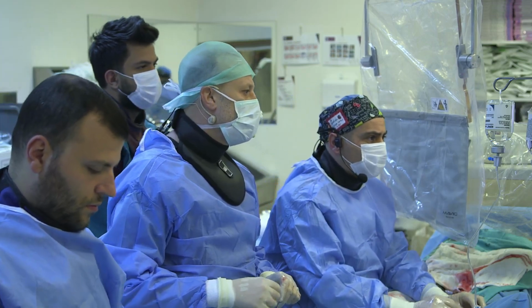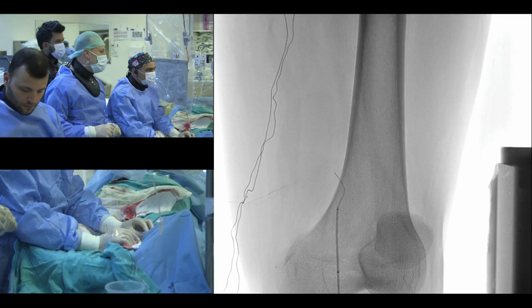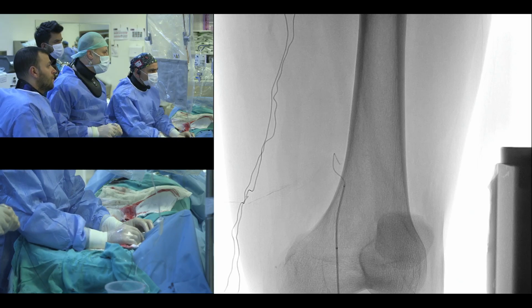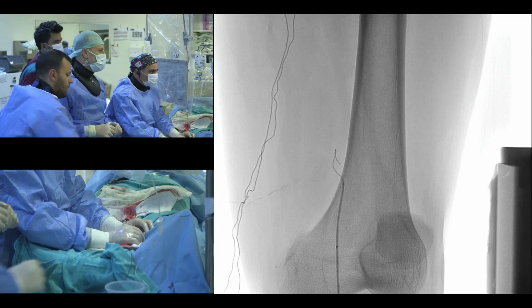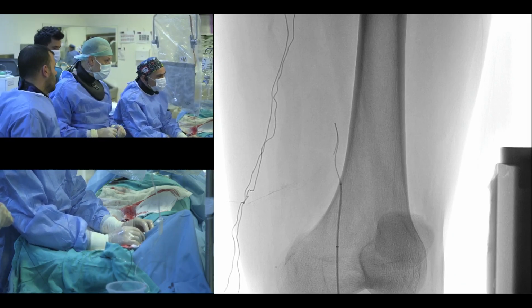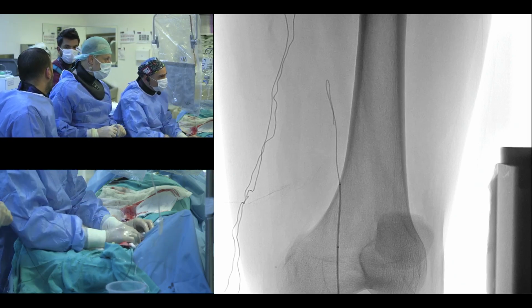Gel. Evet, loop'unu bir görelim. Küçük biraz loop yapsın. Küçük loop yapalım. Ersan, did you change the wire? Yes, this is Roadrunner 035.